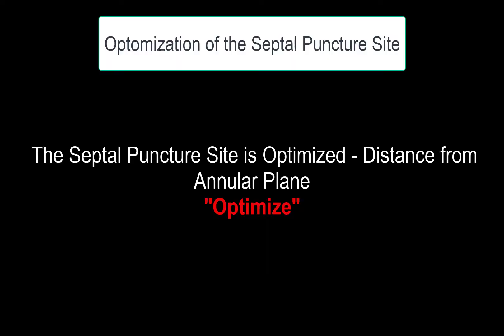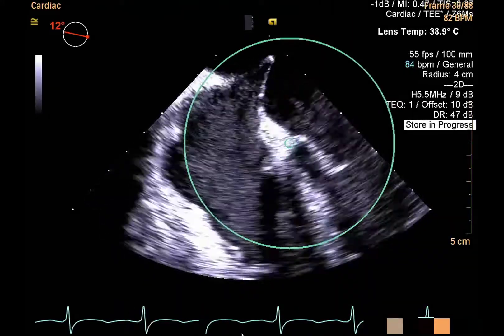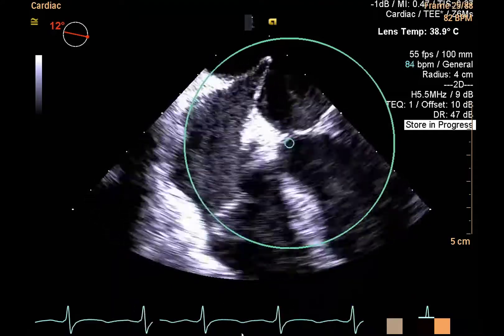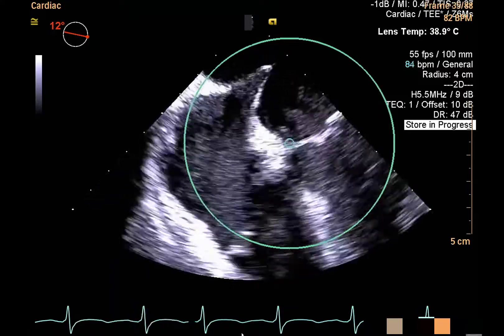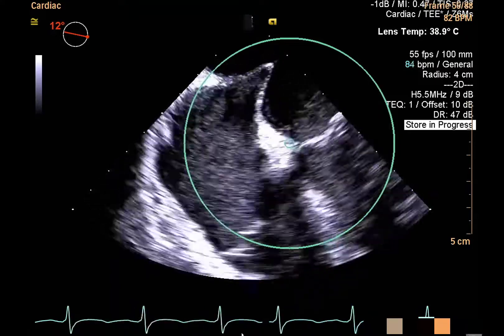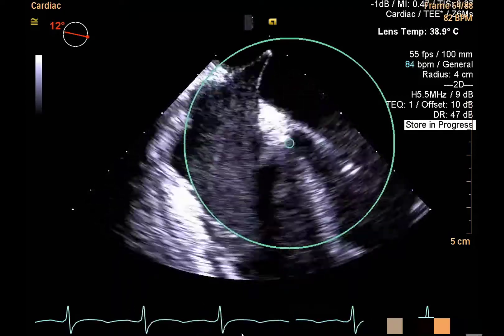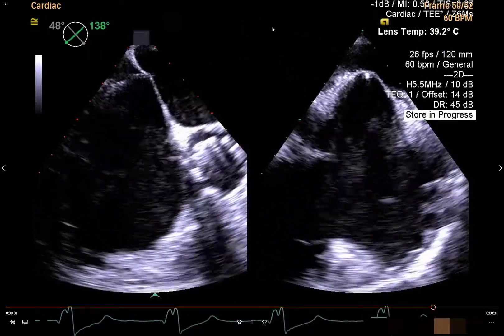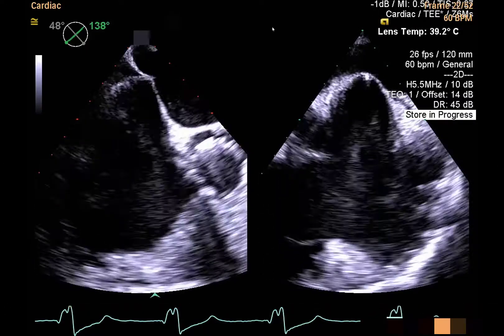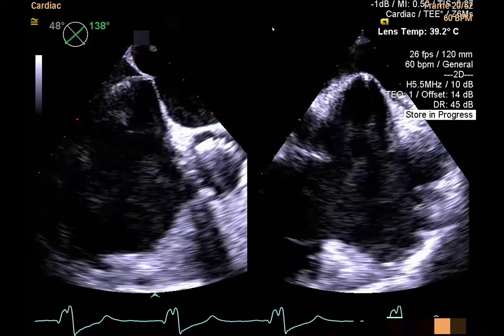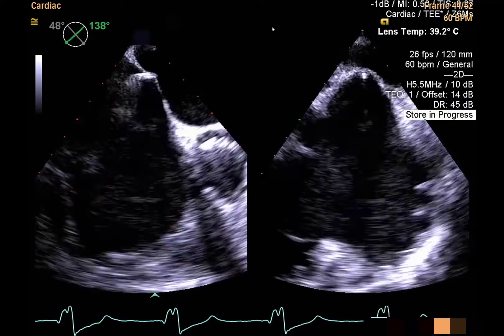At the optimization stage, the operator makes fine adjustments of the needle position. The distance of the septal puncture site from the plane of the mitral annulus should be around 4 cm, and it is measured in the mid-esophageal four-chamber view. A septal puncture guide of a known radius can be used to facilitate quick measurement. Once the measurement has been made, simultaneous orthogonal images of the septum are displayed again to confirm the optimal position and exclusion of needle drift from its original position.